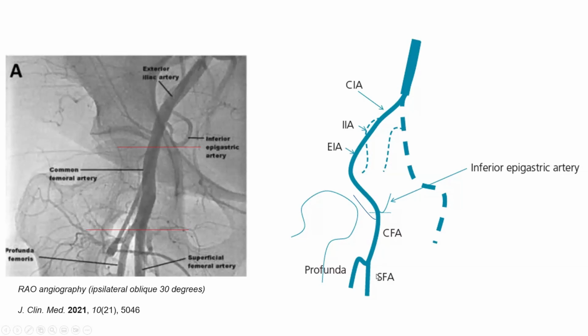We don't want to stick the SFA, but SFA at least is more superficial and it's a less risky stick than those other two.